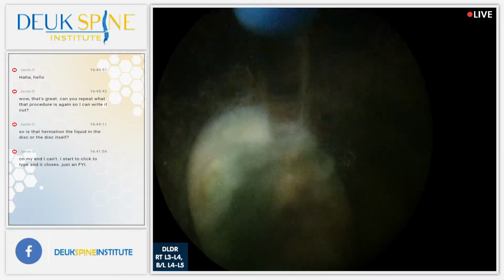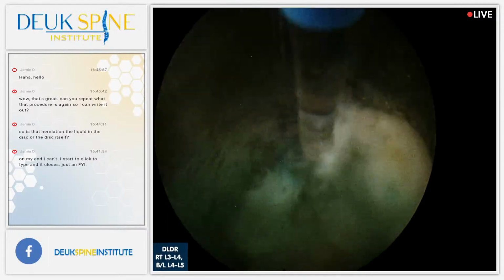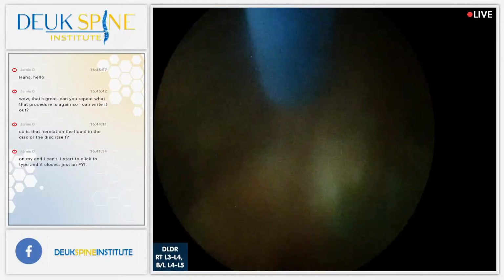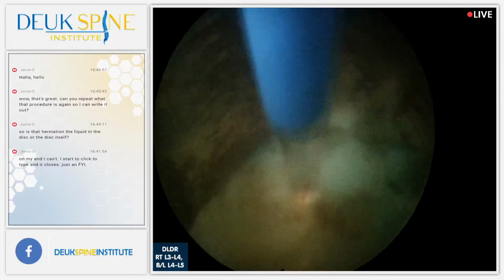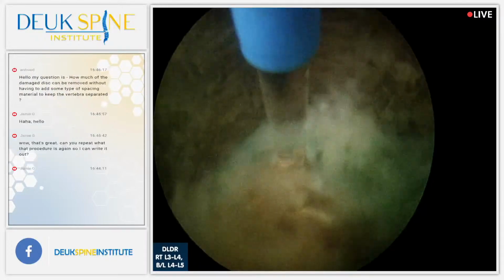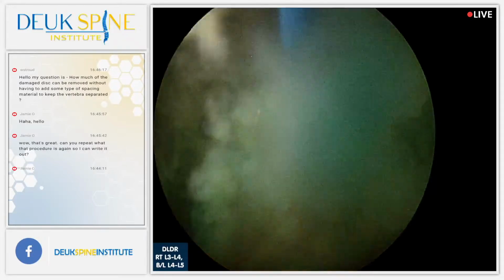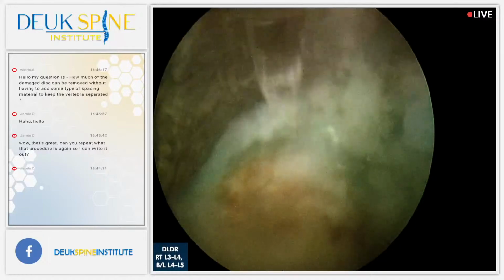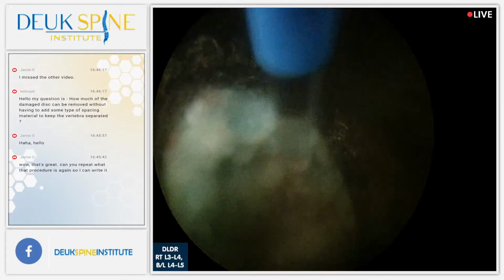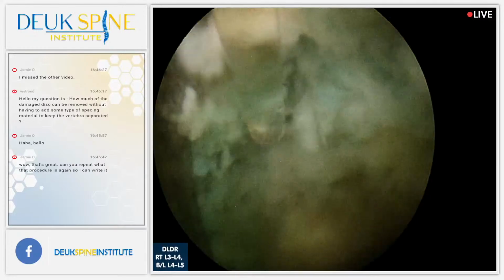Great question, Jamie. We are not. So did you run the video on the Deuk laser disc repair? Yes, we ran both. Let's run it again. I'm going to show you because they say a picture's worth 1,000 words. Jamie, take a look at this video and you'll see what we're doing is we're cleaning up the tear in the back of the disc where the herniation of the nucleus came out of. The blue stuff is the herniation. So not only are we cleaning the tear, but we're also cleaning out the herniation that's stuck in it. Let's run that educational video for Jamie.